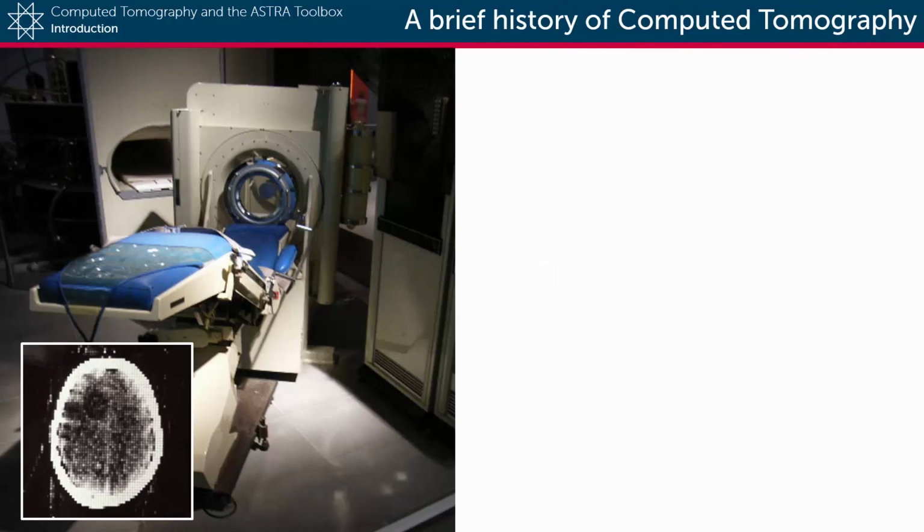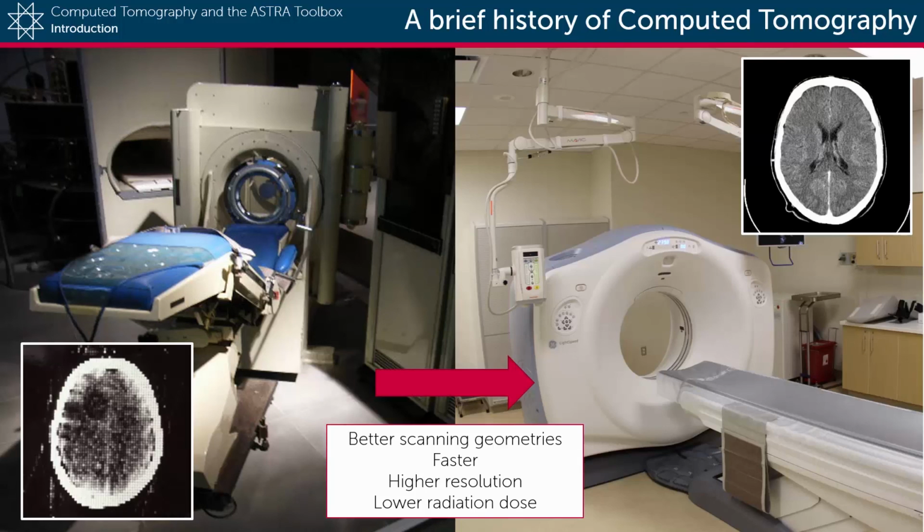And of course, since then, advances in computer science and in X-ray technology have greatly improved the CT scanners that you will find in your local hospital. Modern machines work much faster and are able to achieve a much higher resolution at a much lower radiation dose.